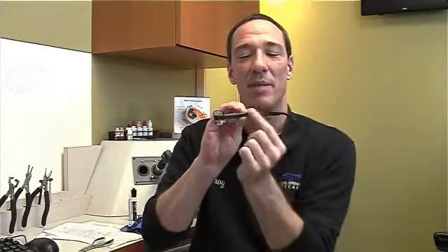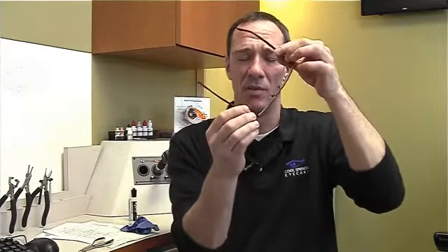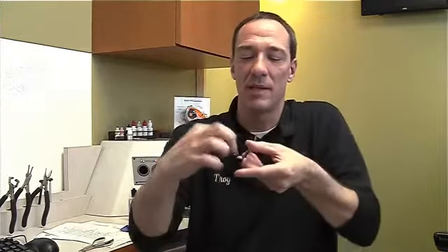Eyeglass frames come in many materials, like metal and plastic. I happen to have one that's both, and we have the front of the frame being metal and the temples of the frame being plastic. And of course, they have a little screw or a hinge where they're connected. This one happens to be the one that opens and closes the glasses, and we call that the hinge temple. And it has a screw that we can tighten, and it's usually right in the top.